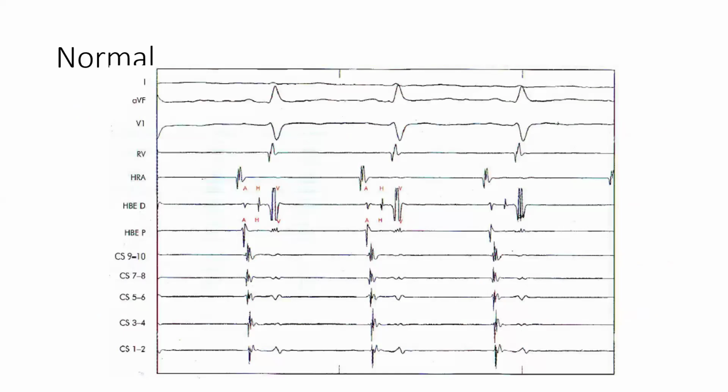Now, let's go to the basic EGM that you see. So we said that when you're seeing an EGM, you would see the surface ECG. So you can determine the type of surface ECG you want and the number of surface ECG you want. So this is like a standard 3-lead surface ECG.